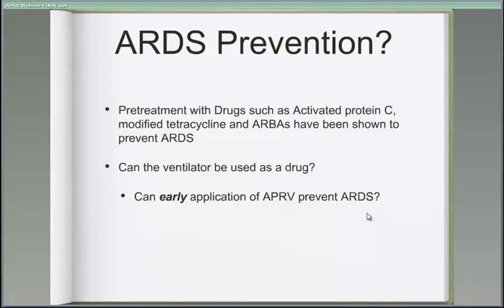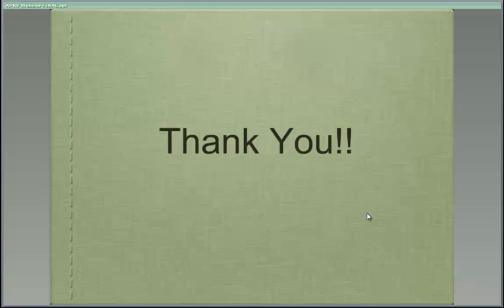But can the ventilator be used as a drug, a phrase that Gary Nieman has coined? And I tend to agree with him that perhaps the ventilator, through some mechanism, if applied early, can actually prevent the lung from getting edematous, which is really the hallmark of ARDS. It's intra-alveolar flooding or edema. And so maybe we might have an alternative approach to ventilation.